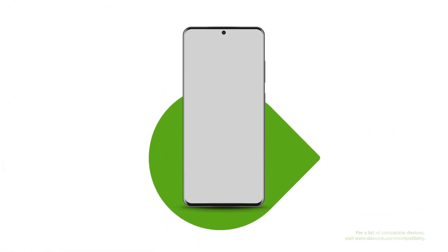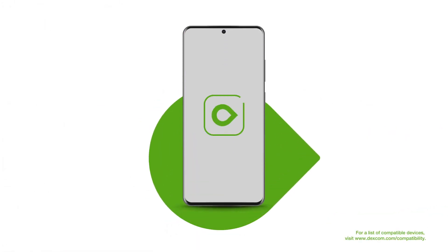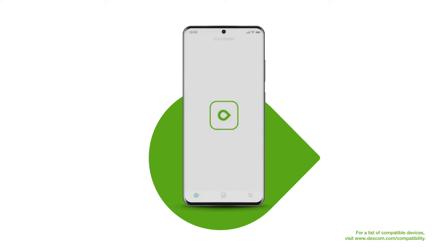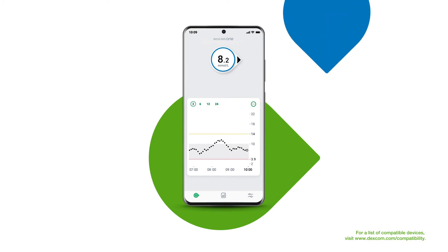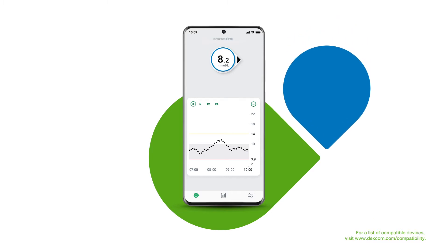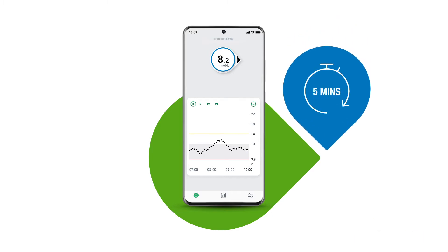The Dexcom One app is the key to keeping track of your glucose levels. See the number in the white circle? That is your current sensor reading. It tells you where your glucose is now and it updates every five minutes.